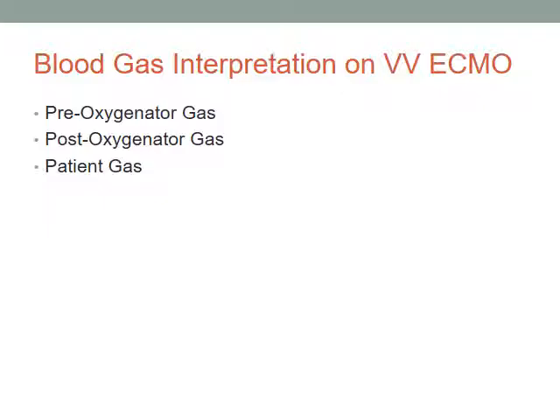So worsening oxygenation: sweep gas can be disconnected, the oxygenator can be not working, the cannulas can be malpositioned, perhaps leading to increased recirculation. Circuit blood flow may have been turned down by the perfusionist, maybe because the patient was having chatter. Fever and agitation increase oxygen utilization. Anemia causes low central venous sats. All sorts of things can be playing a role here. Okay?